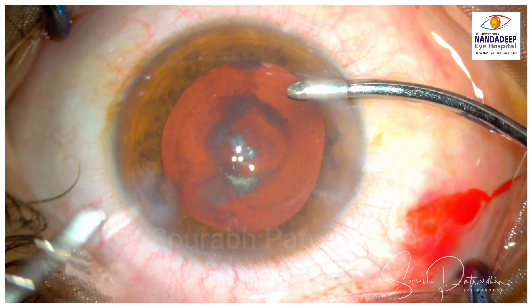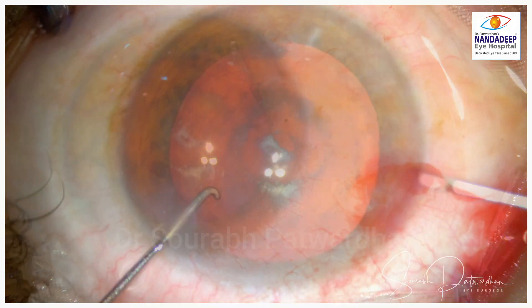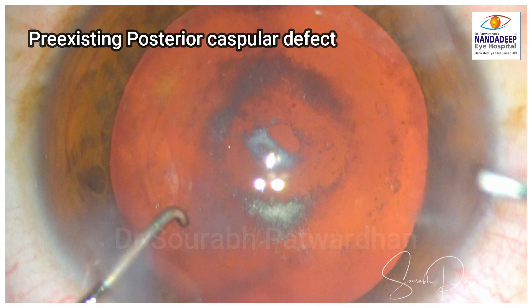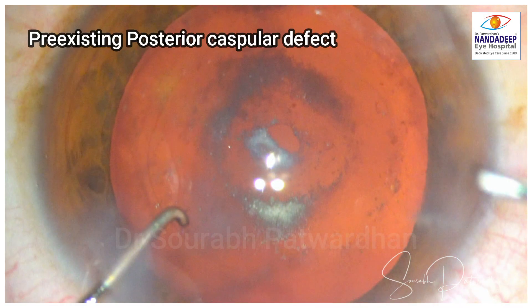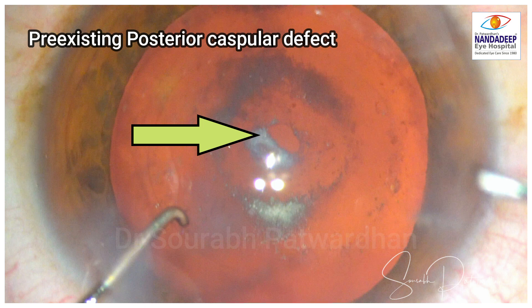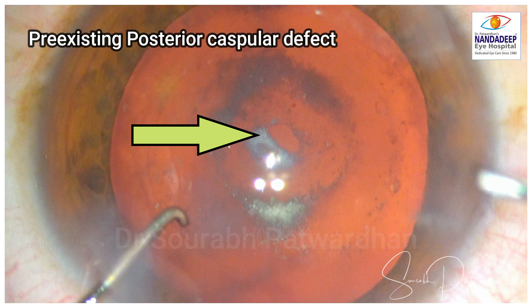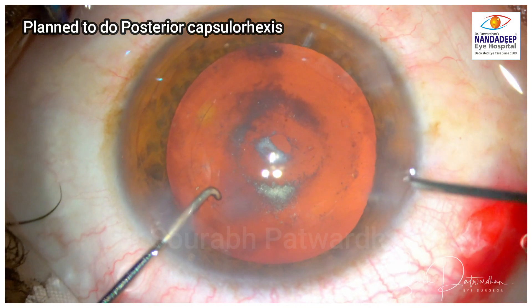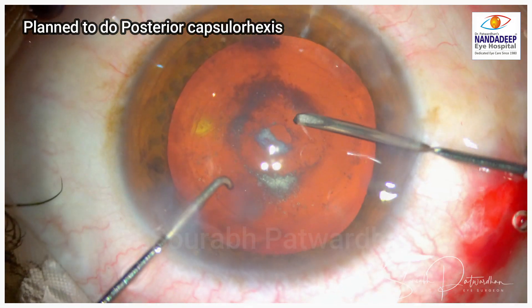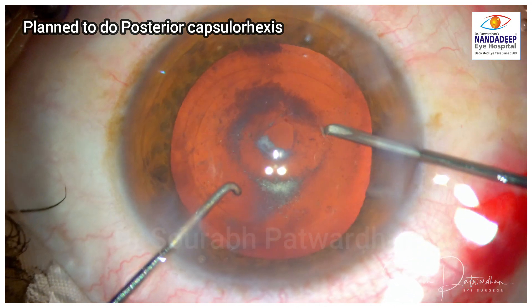You can see there is a pre-existing breach in the posterior capsule right there. I don't know how the margins are — if there are fibroses, that's good, they will be strong. I decided to convert it into a posterior capsule rhexis. I also wanted to take out some of those opacities you can see here.